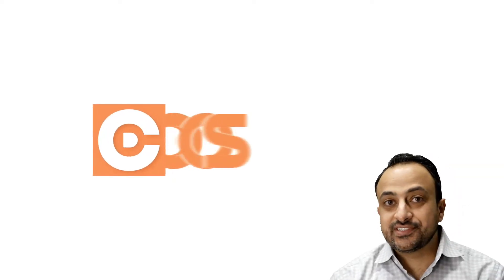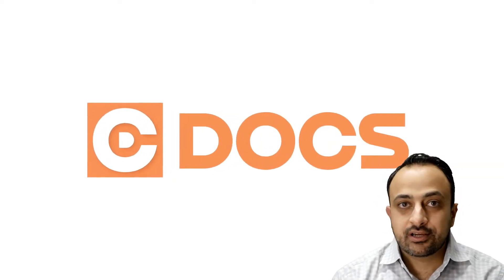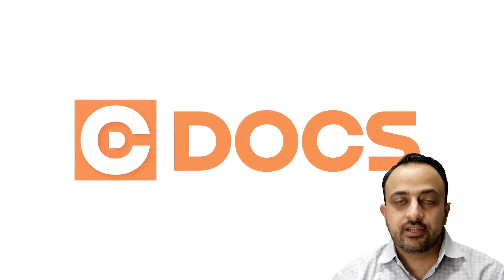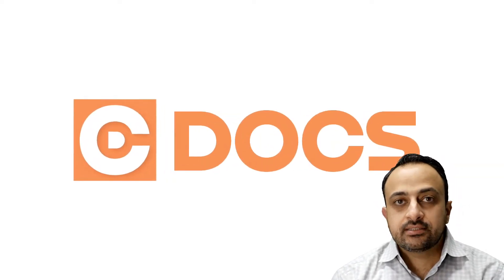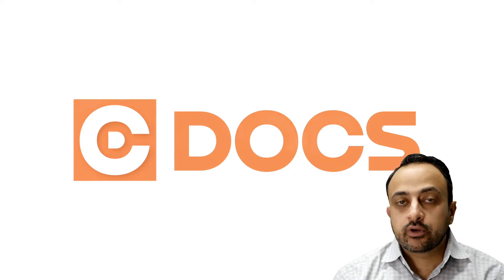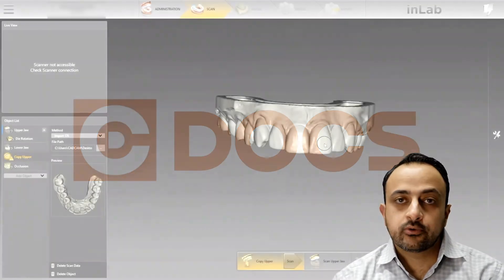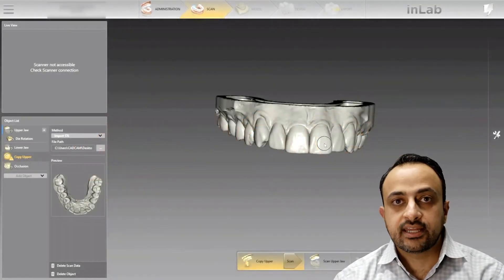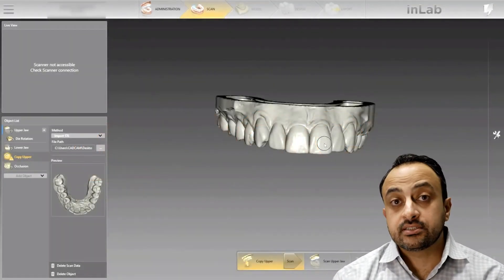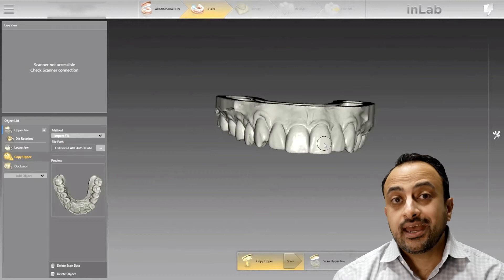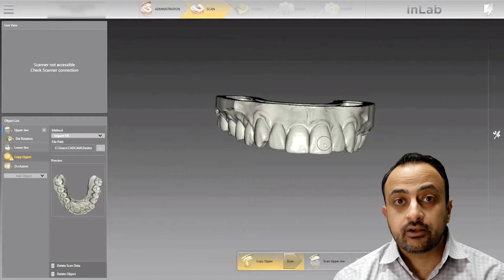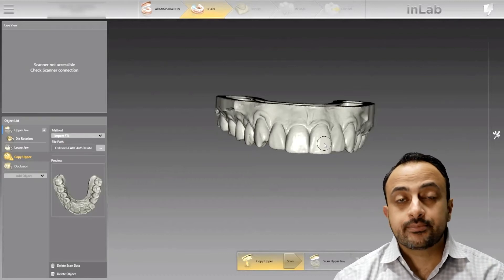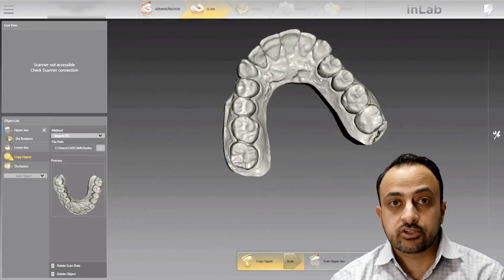This is Mina Barsoom with C-Docs, and welcome to the tip of the day. Today I want to show you one of the most powerful tools we have in the InLab software, and that's the ability to stitch STL files from wax ups and preparations.